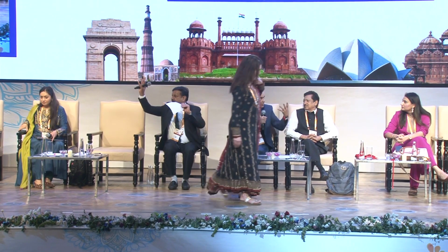Thank you. Sonu, I'd just like to add something. My first exposure to a low-power phakic lens was a couple of years ago. I had a couple from the American Embassy, husband and wife, both were Americans, 2 and 2.25 diopters approximately both, and they both asked for a phakic lens because they said it's reversible. And that's when it opened the box for me that, okay, I can open these options. So I open these options to patients who come to me for a refractive correction, even at a lower or moderate power. I tell them, here is a reversible procedure. Here is a procedure which costs less, but not reversible. Take your call.